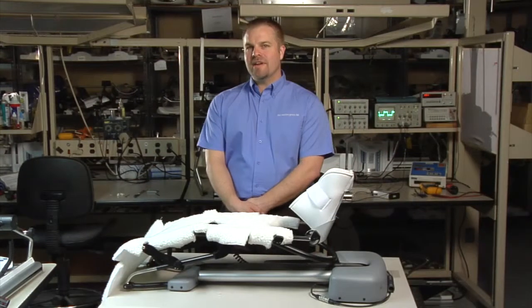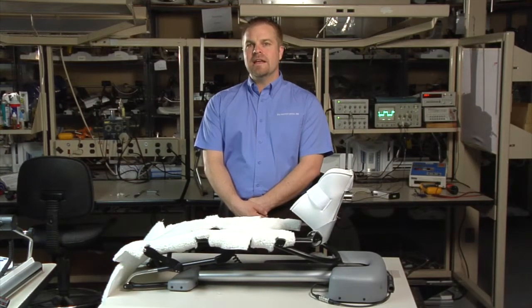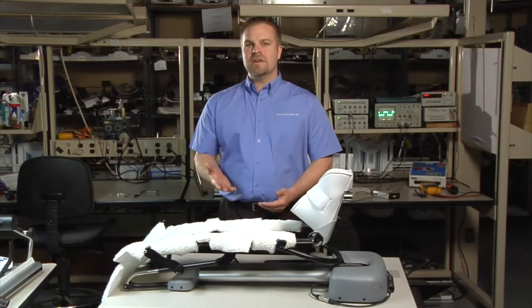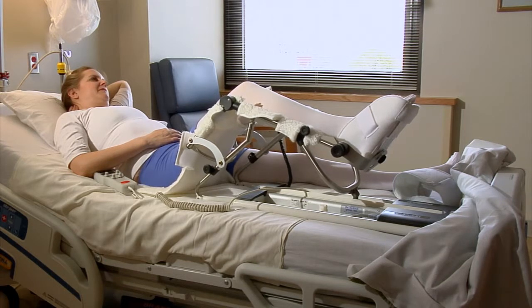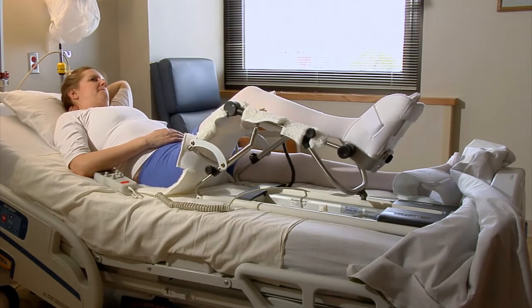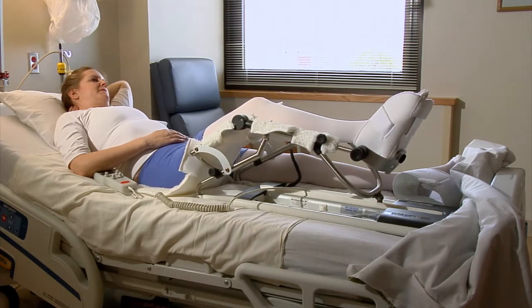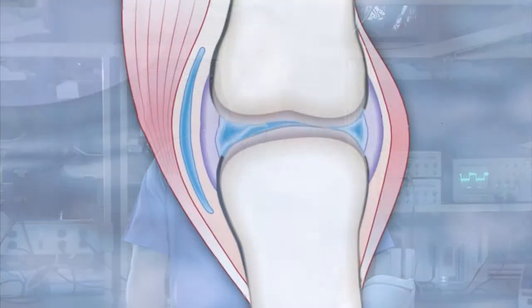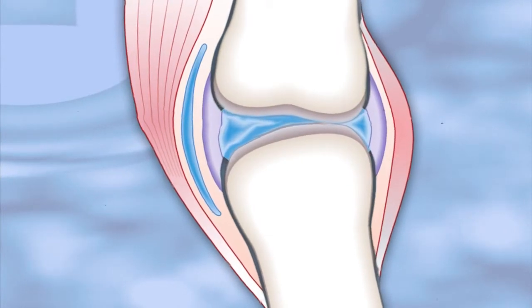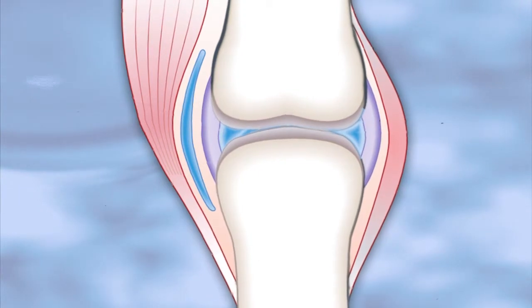The CPM machine benefits the patient in many ways. Generally, when you have injured a part of your body, it's recommended that you elevate the injury to help reduce the swelling. When you place a patient's leg in a CPM machine, you not only elevate it, but also passively move the repaired joint. The combined effects of the elevation and the gentle motion help to pump the swelling out of the knee. In addition, the gentle motion helps to mobilize the synovial fluid and nourish the joint surface, which also helps to inhibit the growth of intra-articular adhesions or scar tissue.